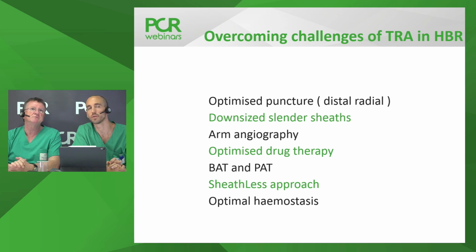Pigtail assisted tracking is a version of that. If you have an 0.035 wire that's in situ in the proximal aorta, and you're worried about tracking a 6 French guide, if you put a 5 French pigtail inside it, it will poke out the end of the guide and it will do the same thing. It will smooth the transition.